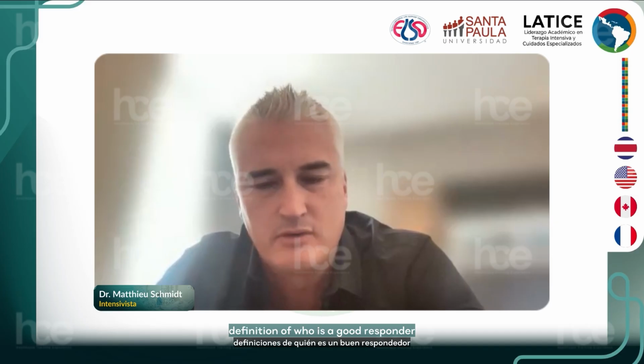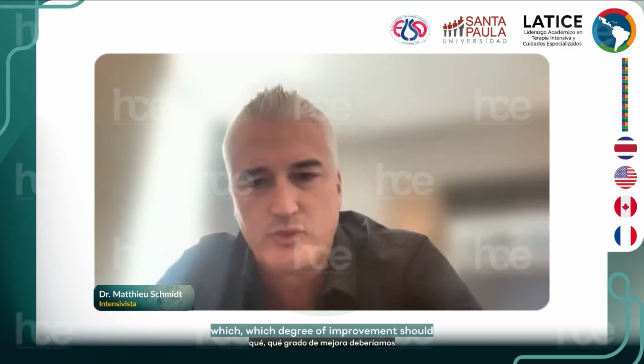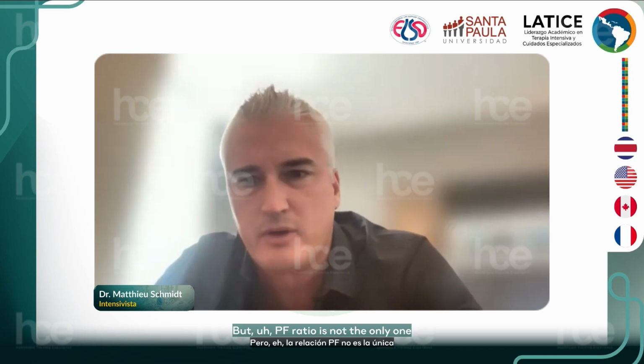We all have various definitions of who is a good responder, and which degree of improvement we should expect with this procedure. I think it's still an open question, but I will say PCO2 decrease first, and maybe PF ratio later, but PF ratio is not the only one.